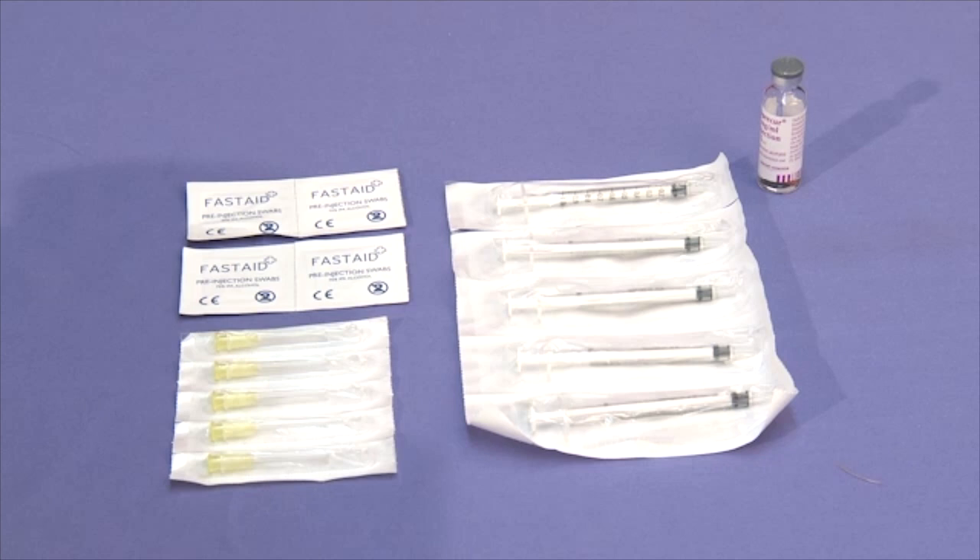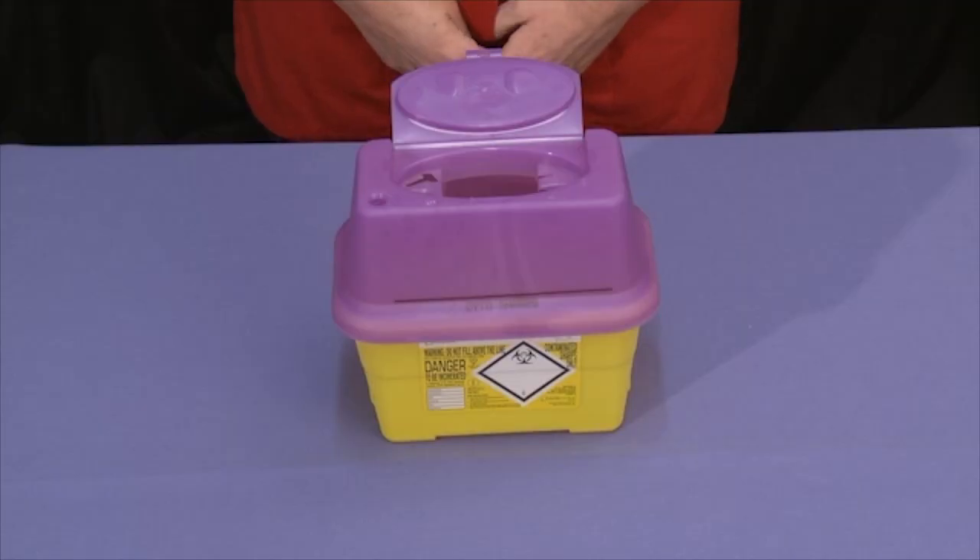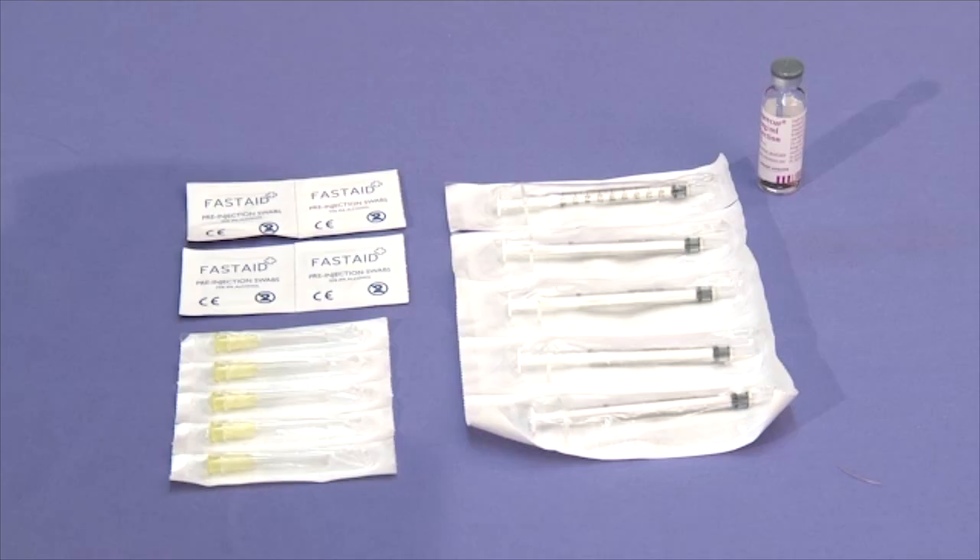To be able to inject yourself with Bucerulin, you will require 1ml syringes, yellow needles, alcohol wipes, and a sharps bin. These items may be given to you by your clinic or they may have been obtained as a kit from Farmersure.